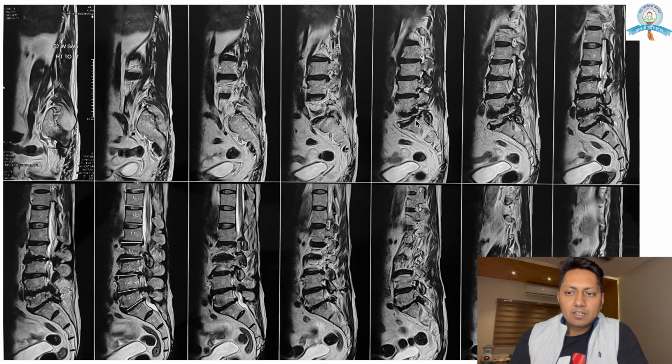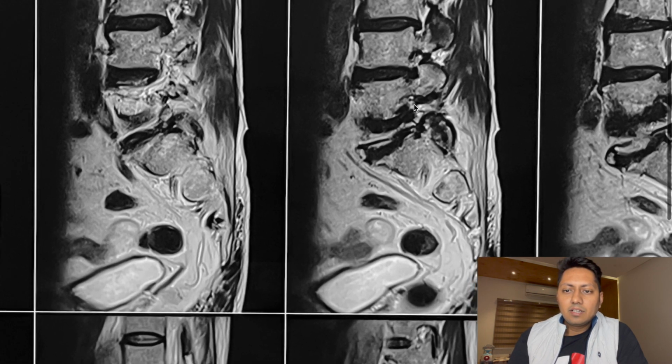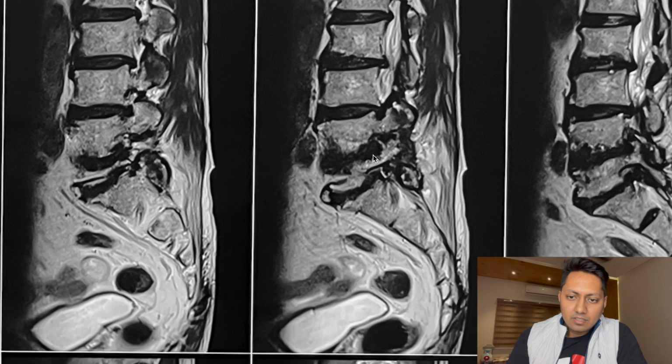So in this sagittal cut, I'm going to just zoom in over here. You can see that this is the L4 L5 level, and this is the L4 exiting root and it is getting compressed in this foramen. You can see other images. You can see this disc is bulging, which is compressing it against this pedicle, and there is ligamentum flavum over here. So the L4 nerve is getting compressed as it is exiting here.